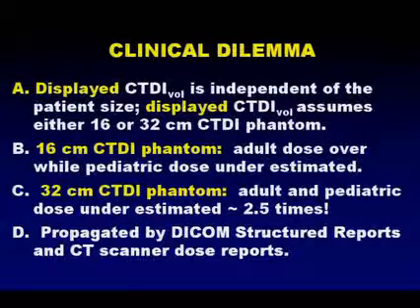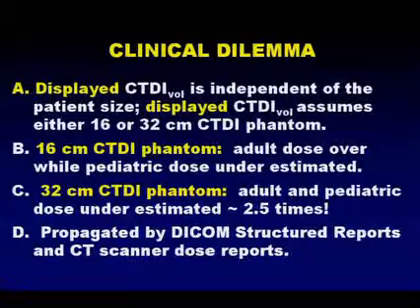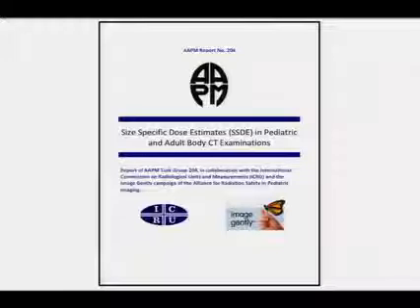And of course, what's being propagated and stored in the DICOM structured report? The CTDI vol. And of course, it really doesn't represent at all what's going on with dose in the pediatric world. It's not a good representation in kids. It's not too bad in adults.